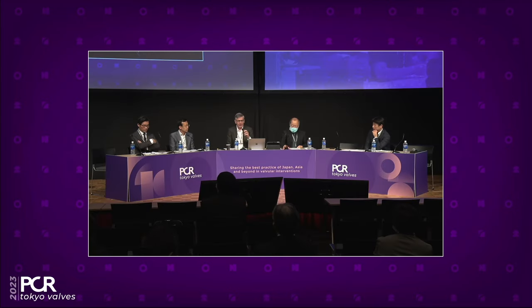So, I would say this looks like a potentially challenging case. The patient has severe aortic valve calcification. We know that will increase the risk of paravalvular leak after a TAVI procedure. And maybe particularly in a patient with impaired LV function, ejection fraction down to 28%. Kentaro, would you be concerned about PVL in this patient and also the outcome?